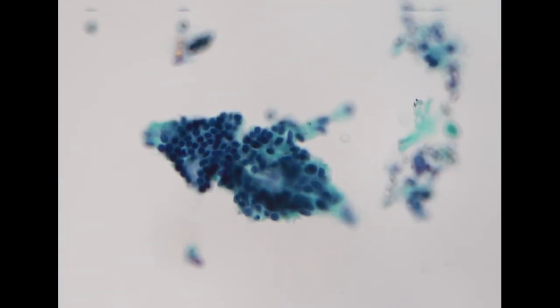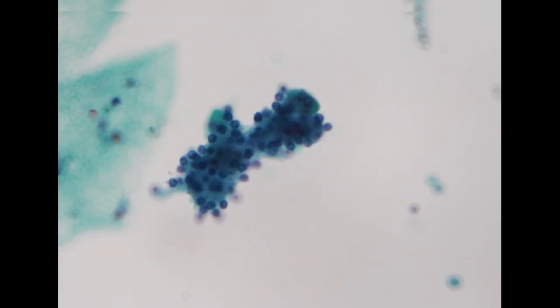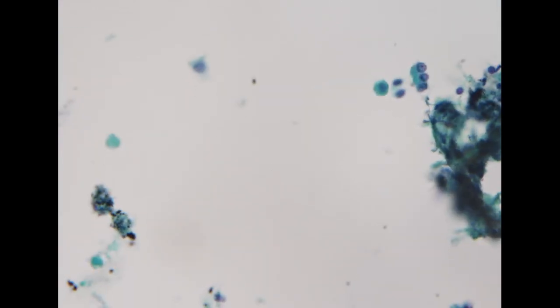And the good thing about aspiration, like EUS-guided aspiration, is that it's not uncommon that you can see reference cells. So this is nice honeycombing benign ductal cells. And here, this is a cluster of adenocarcinoma. Again, this is adenocarcinoma, and this is benign acinar cells of the pancreas. And you can appreciate the differences in the size of the nucleus as well as the prominent nucleoli. So this is positive for adenocarcinoma.